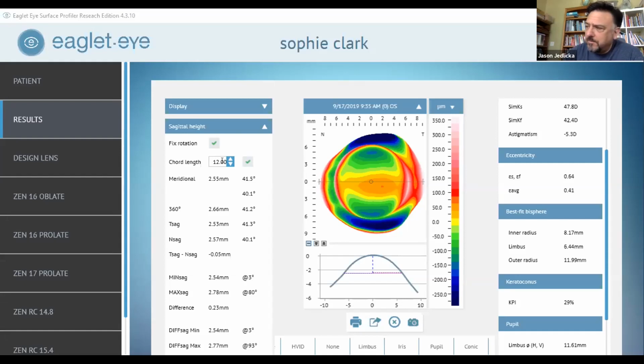And so when I refitted her this year, we refitted her into a bi-elevation lens, which basically just means that we took that 430 microns of difference that we had previously built into the haptic, and we put about half of it into the vaulting chamber of the lens, so that it was built into the peripheral or the mid-periphery part of the scleral.